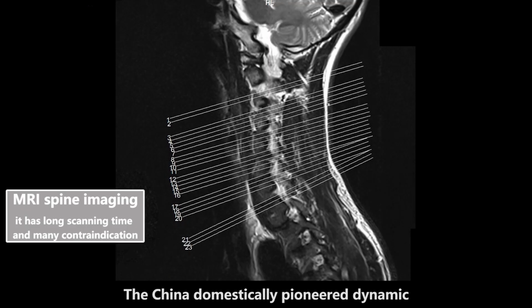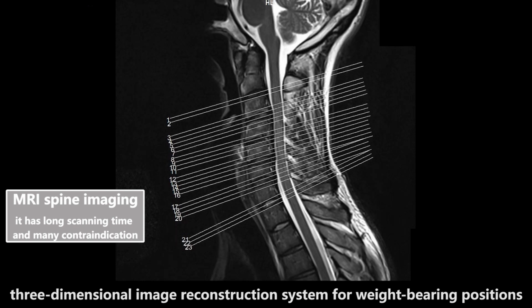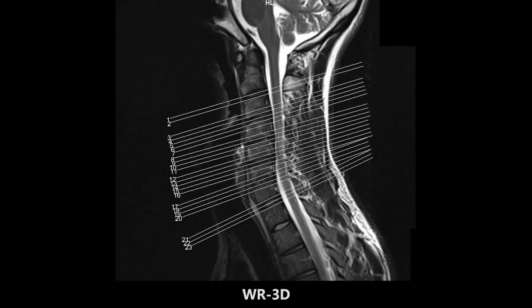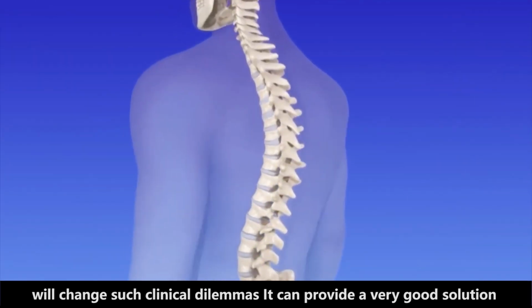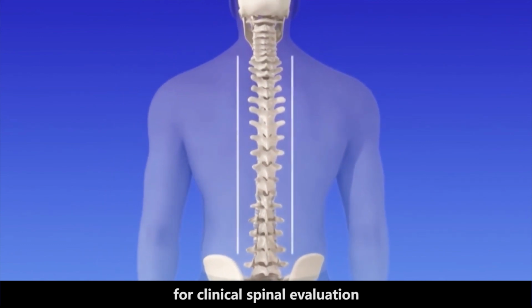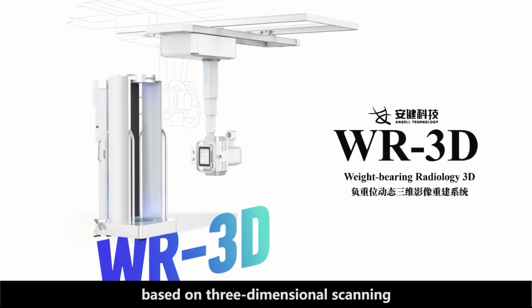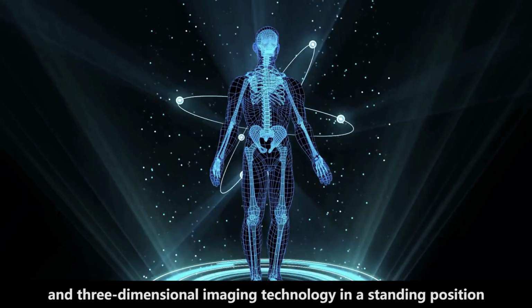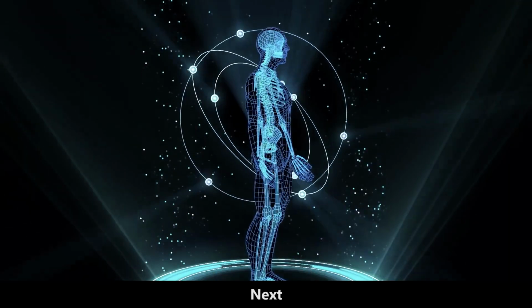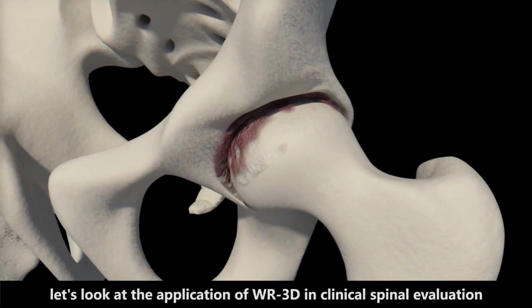The domestically pioneered dynamic three-dimensional image reconstruction system for weight-bearing positions in China, WR-3D, developed by Angell Technology, will change such clinical dilemmas. It can provide a very good solution for clinical spinal evaluation, whole body posture evaluation, and lower limb and hip joint evaluation based on three-dimensional scanning and three-dimensional imaging technology in a standing position. Next, let's look at the application of WR-3D in clinical spinal evaluation.